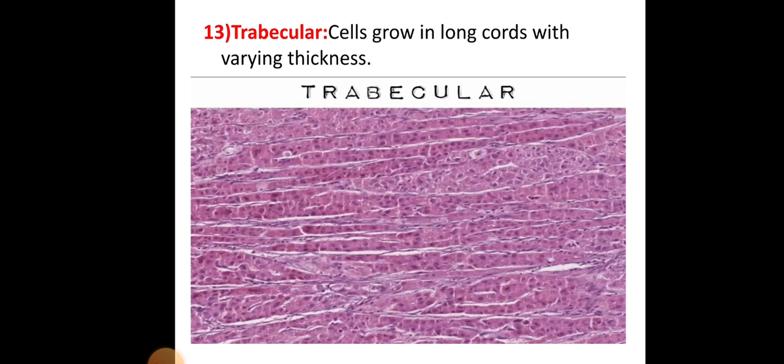The trabecular pattern is where cells grow in long cords with varying thickness.